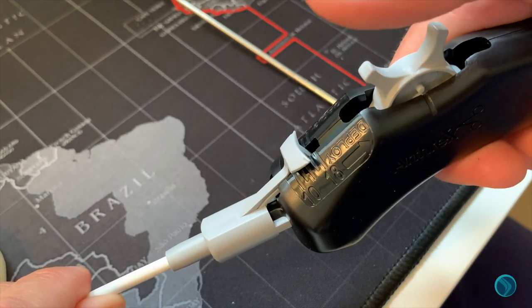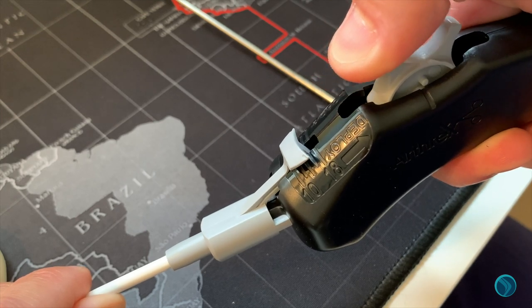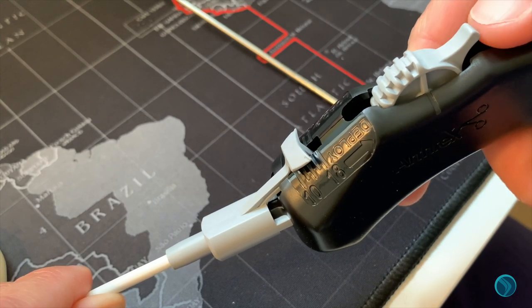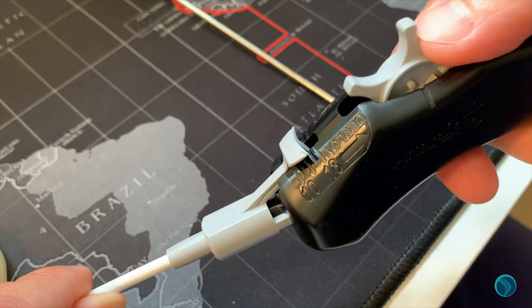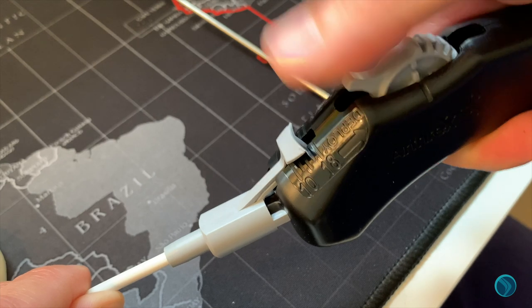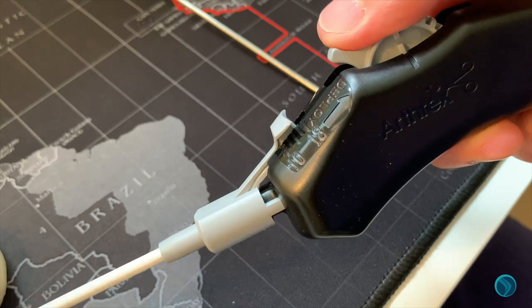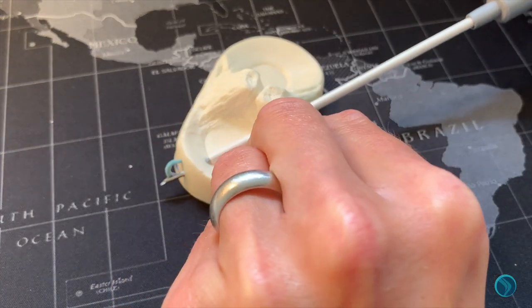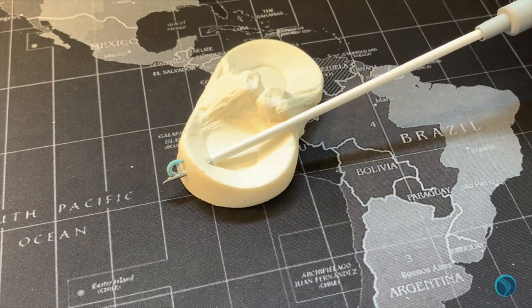Once the device is through the posterior capsule, rotate all the way back until you feel a click, and then rotate all the way forward until you feel a second click. You can tell that it's deployed with the two bars here.